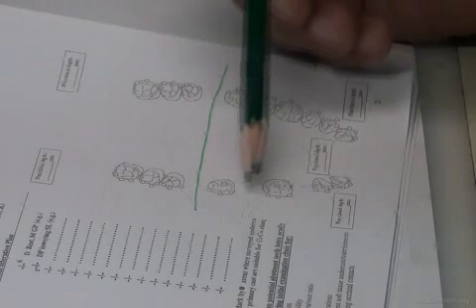I have an option where if the teeth are very strong around it, even the rests I could remove them if this was an upper. Okay? If this pier abutment was an upper tooth, I have also some support from the palate, so I also could remove the rests even. Okay? So pier abutments are challenging. We try to minimize components on them as much as possible. Okay? A major connector here.